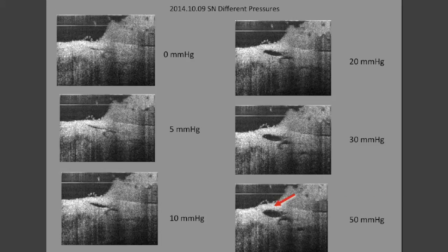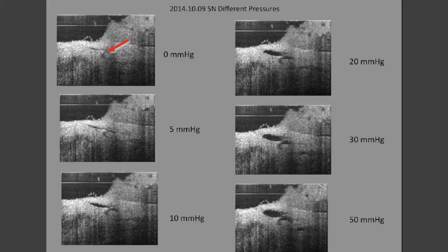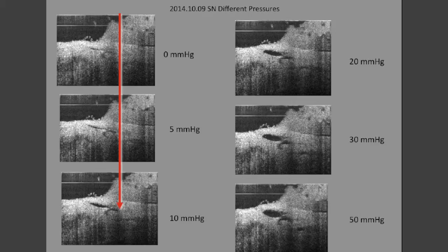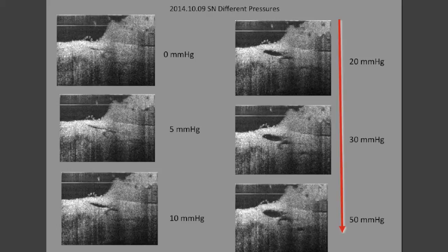At 50 millimeters of mercury with a cannula in Schlemm's canal, we can visualize the trabecular meshwork, Schlemm's canal collector channel entrance, intrascleral collector channel, as well as a deep intrascleral plexus channel. At zero intraocular pressure, Schlemm's canal is just a potential space, as is the collector channel entrance and the intrascleral collector channel. As pressure gradients increase progressively, there is a progressive increase in the dimensions of each of the structures including Schlemm's canal, collector channel entrances, and the intrascleral channels.